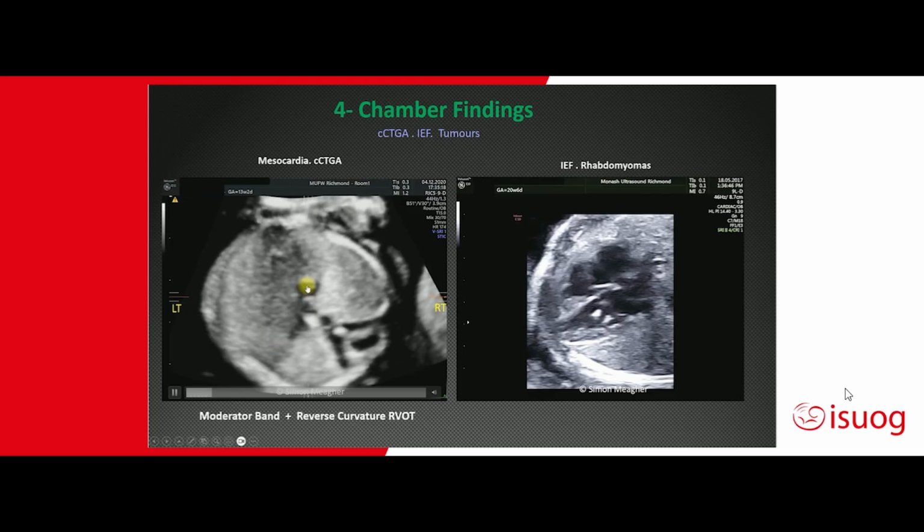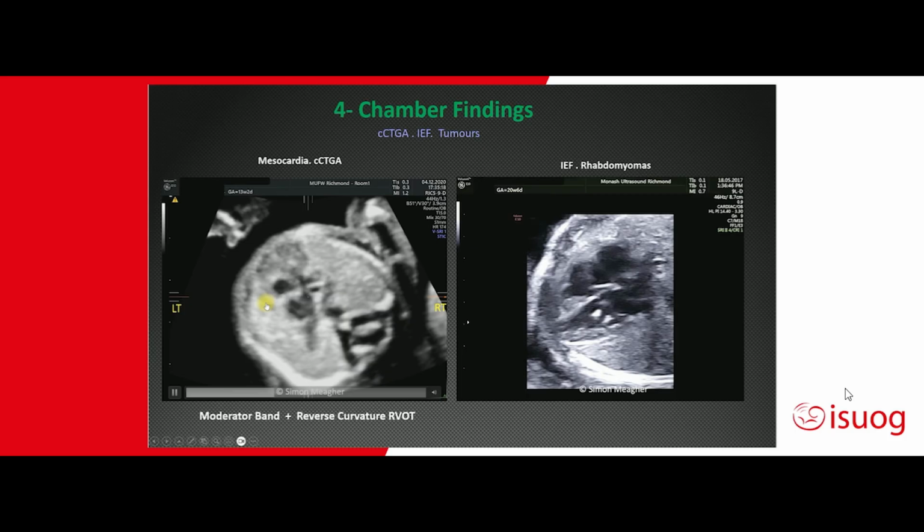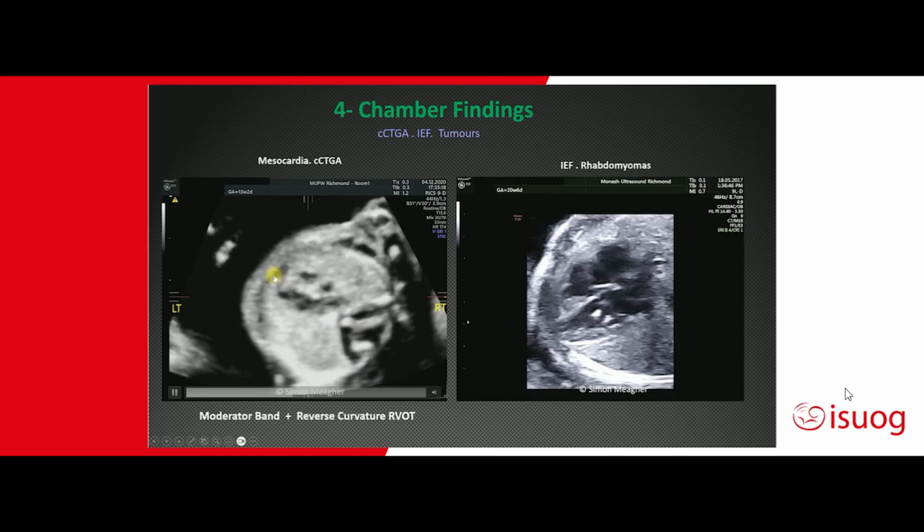And in this case here, when you come across in a four-chamber view of heart, this is the stomach, and the heart situated centrally within the chest. When you look at this, it's got the morphology of a left cardiac ventricle. This is the morphology of a right cardiac ventricle, and there's a ventricular septal defect. So this is congenitally corrected transposition of the great arteries because you see the reverse boomerang of the vessel coming out of the right ventricle.